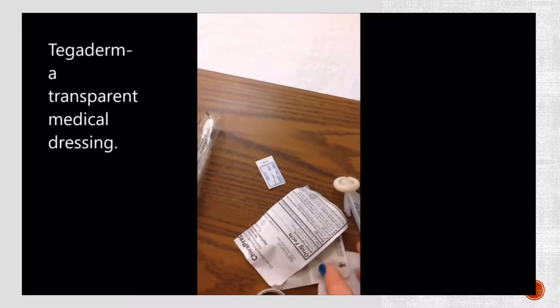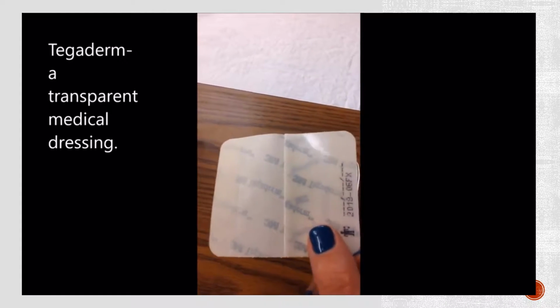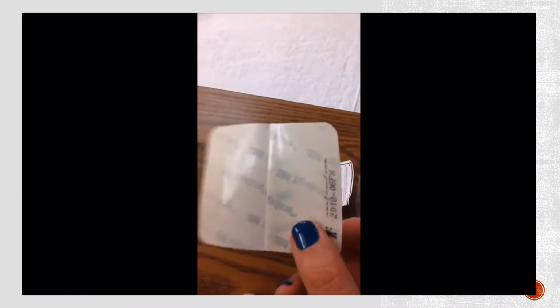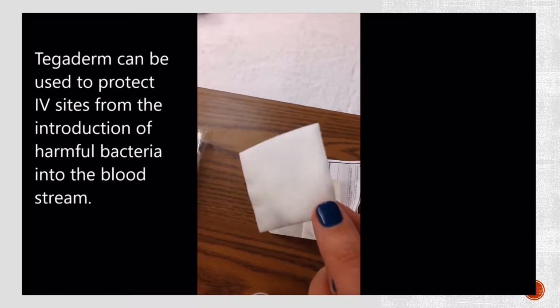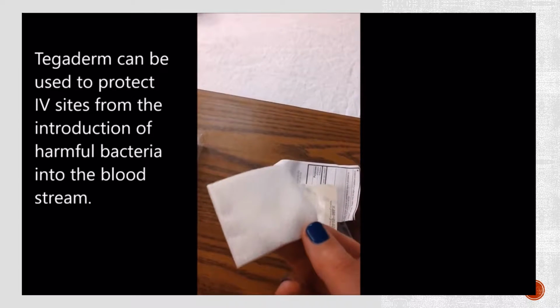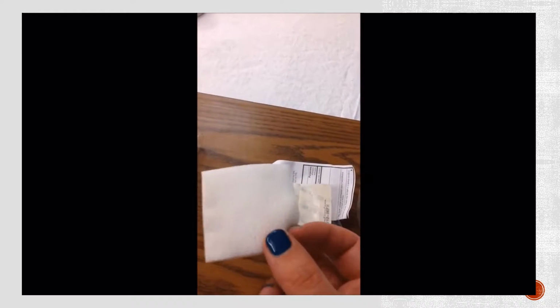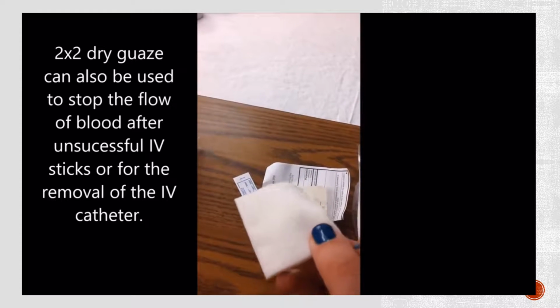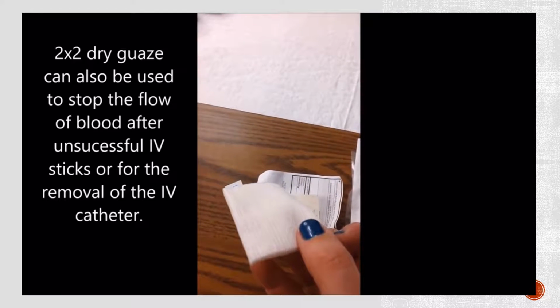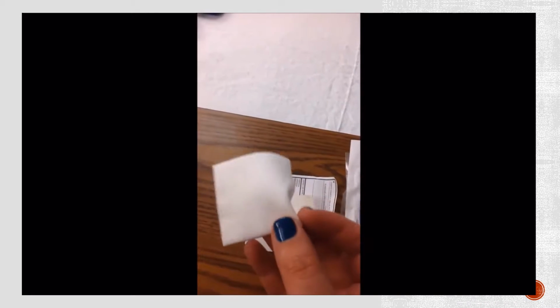You'll also find your tegaderm, which is the clear dressing that you will put over your IV after you start it, and a little 2x2, and you can use this 2x2 gauze under the IV catheter after you start it, or you don't have to. It depends on where it's located. Sometimes it's good to have this to anchor the catheter up a little bit so that it goes into the vein a little bit better, but it just depends on the situation that catheter is in.